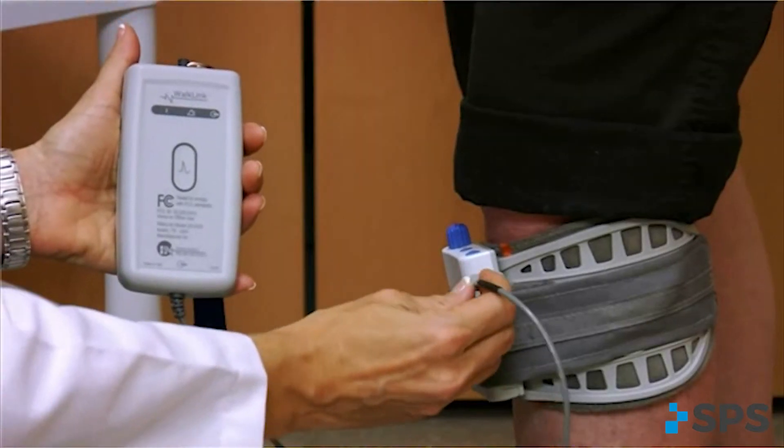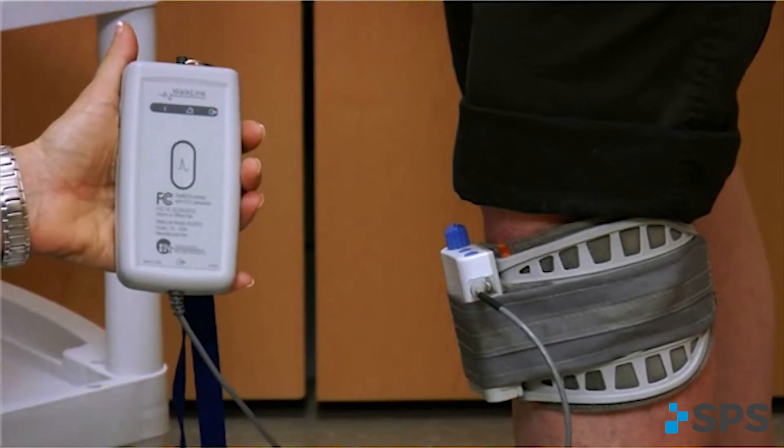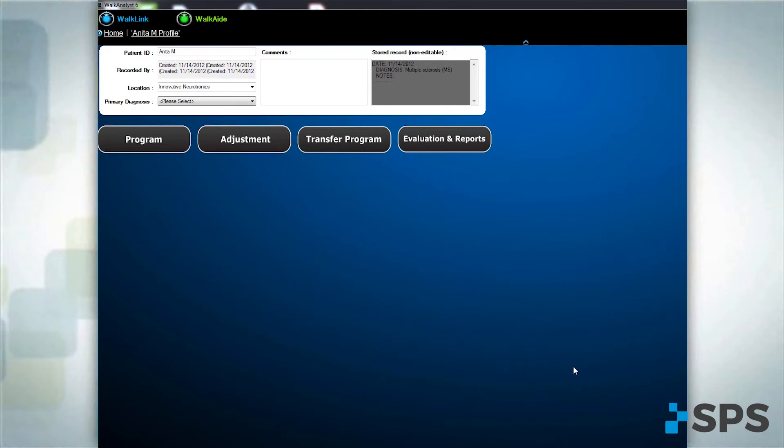To make program adjustments, connect the WalkAid to the WalkLink and open Walk Analyst. Ensure the Bluetooth connectivity is engaged, set the audible beep, and observe the patient walking to identify specific issues.